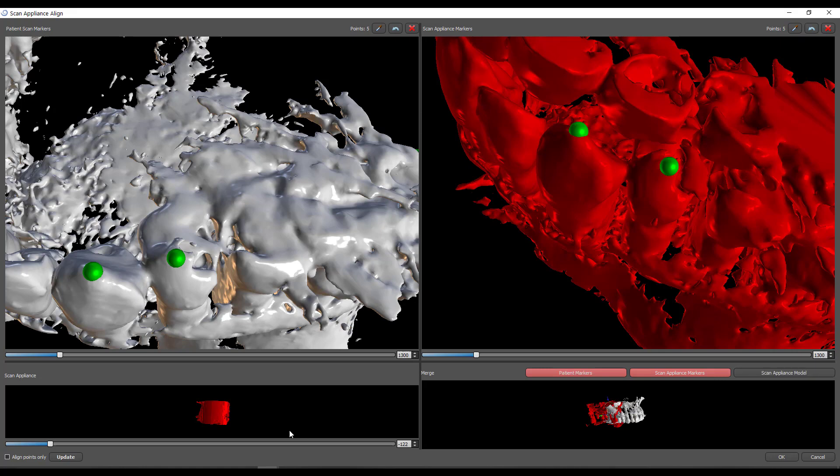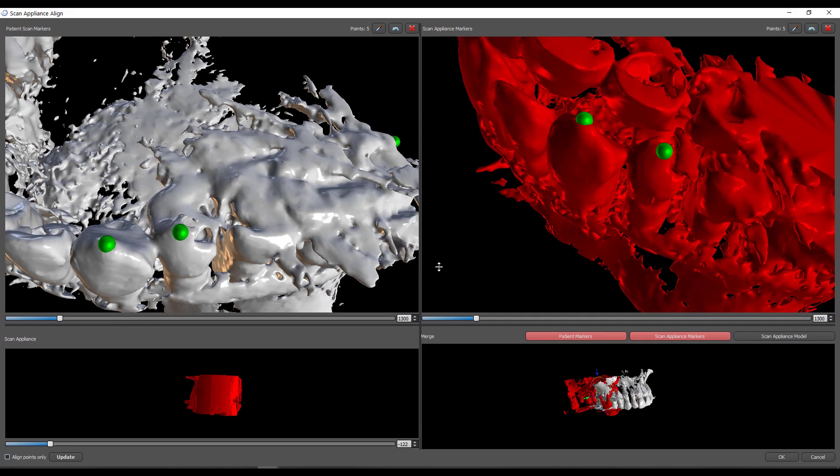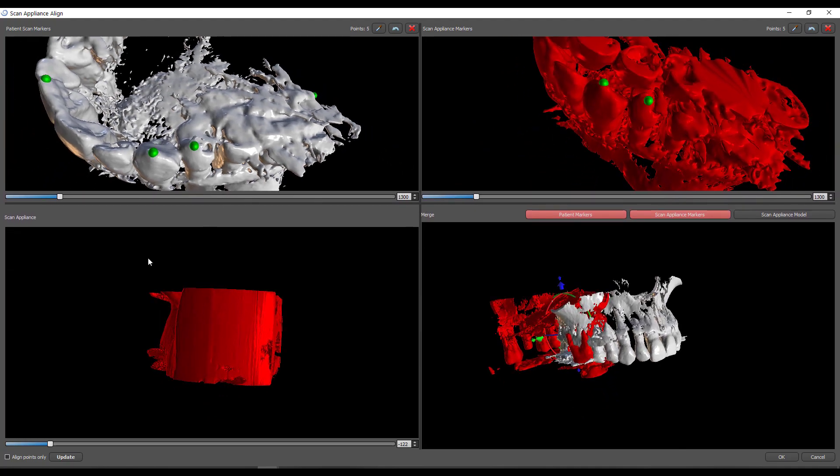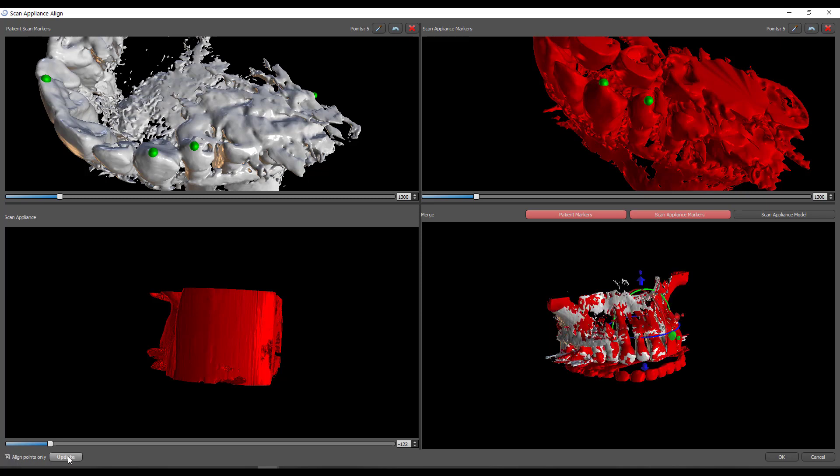And then as I go forward, let's see what area shows up adequately on these premolars. I'd like to get one more tooth in the premolar spot. And it looks like just the top of this cusp tip is good on both of these. So that's five points. And what I'll do, you don't click OK yet. We're not ready to jump forward to that. But what I am going to do is come down here to the bottom and hit align just by points. So ignore everything else and just align it to my points and then hit update.